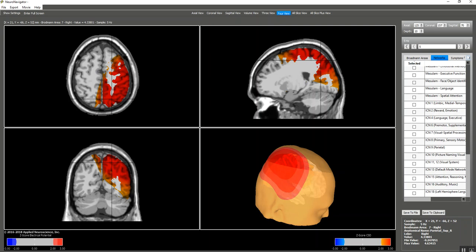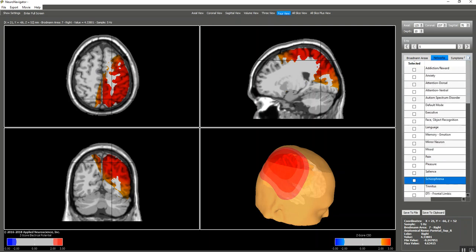They're also in the Connectome publications. And all of these networks are based upon functional MRI and PET and neurological history, such as penetrating head wounds, strokes and tumors, etc. Not EEG, but rather the Human Brain Mapping Program and the Connectome program. And in addition, there are symptoms that these are based upon. Essentially, you identify the most troublesome symptoms of your patient, and then select one that is most troublesome. That will branch to the most likely network.